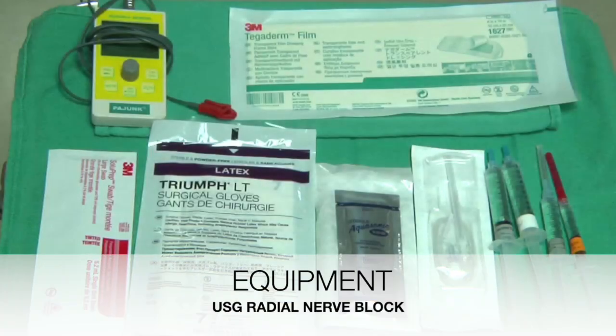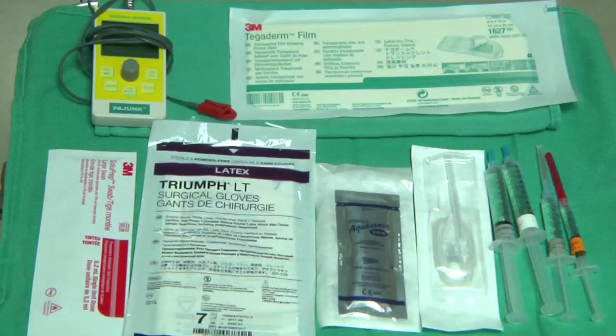For a typical block, we require various equipment. These may include chlorhexidine for aseptic precautions, sterile gloves, a Tegaderm, an ultrasound machine. You may wish to use a peripheral nerve stimulator, sterile ultrasound jelly, a 22 gauge short tip blunt needle, and required local anesthetics and sedatives.